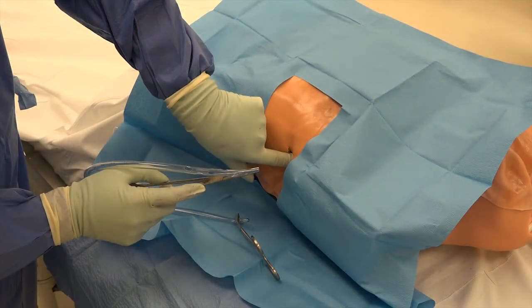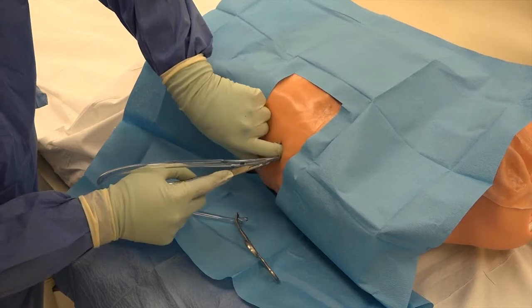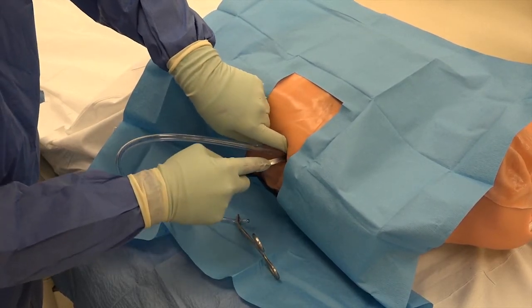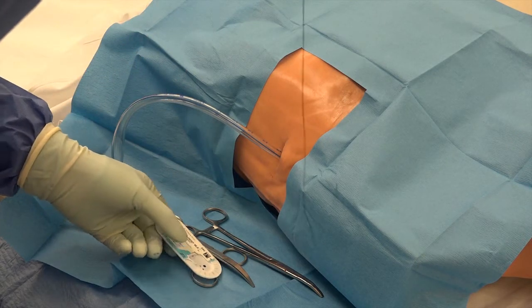Now, place a 28 French chest tube, clamped distally and grasped proximally with Kelly clamps, into the cavity and direct it posteriorly and apically. The next step is to secure the chest tube with a zero silk suture.